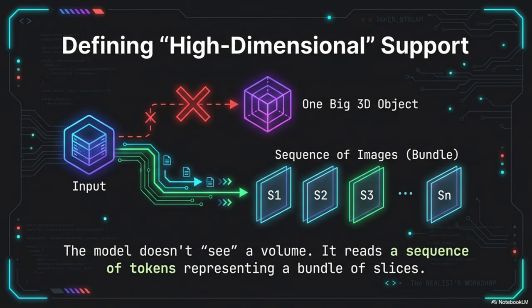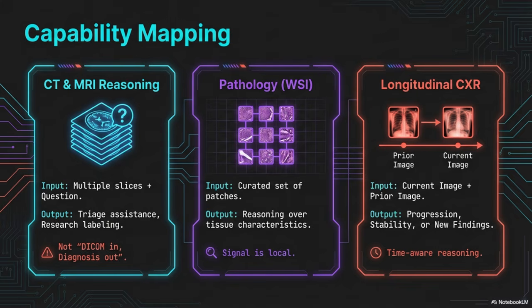Right. No API latency, no recurring cloud costs. Exactly. But beyond performance, it gives you deterministic logging. You can easily replicate failures precisely as they happened. And most critically, it lets you keep sensitive, de-identified samples contained within your own environment. That control is the single biggest reduction in third-party vendor risk you can have. No question.